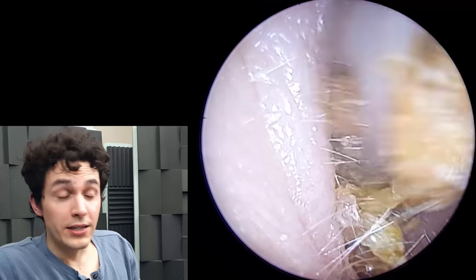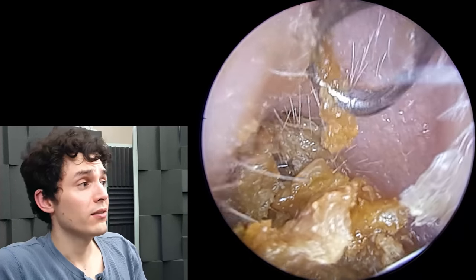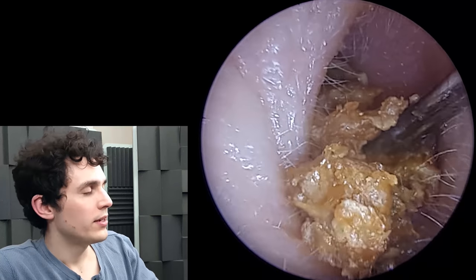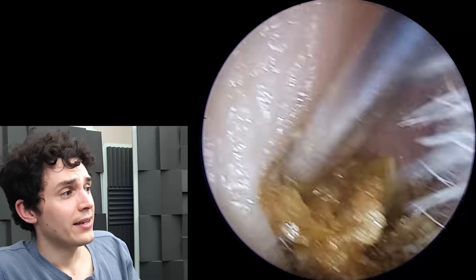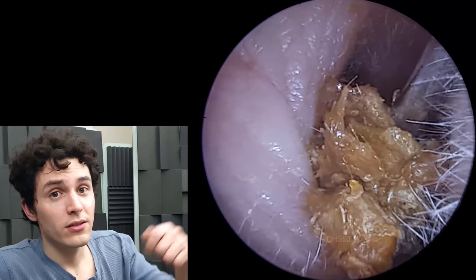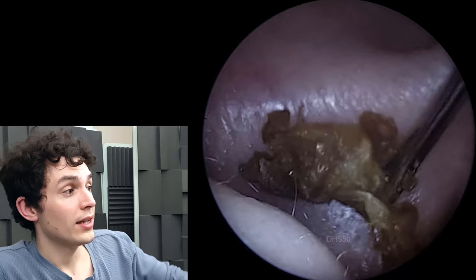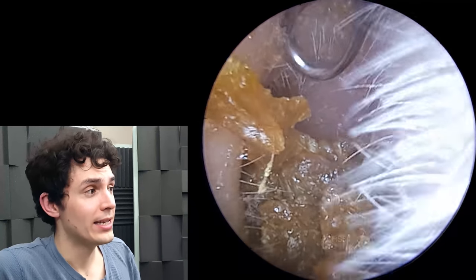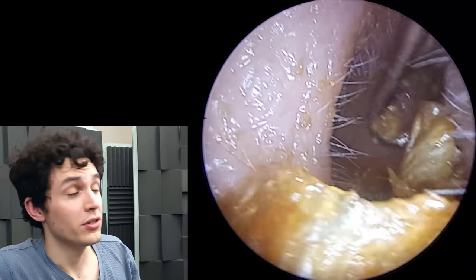Those tools are slightly smaller, as I mentioned. The reason I felt the Formby scoop was a good idea in this case is because it's quick. Because it's essentially a large loop, you can move a lot of debris very quickly. I would never dream of inserting this right down in the ear canal — it's just too large. But because everything's peripheral and at this point everything's made of cartilage, just soft cartilage and subcutaneous fat, I don't mind jostling around and putting a little bit of pressure there just to get the scooping action. Formby scoops are very good if you want to leverage out a lot of debris quickly, rather than having to faff around with the suction or a Jobson horn taking little bits away. A Jobson horn probably would have been okay, but I just wanted something large to get the job done.